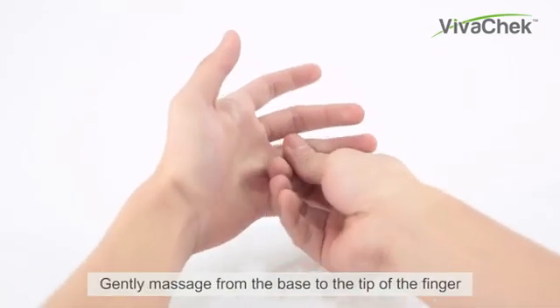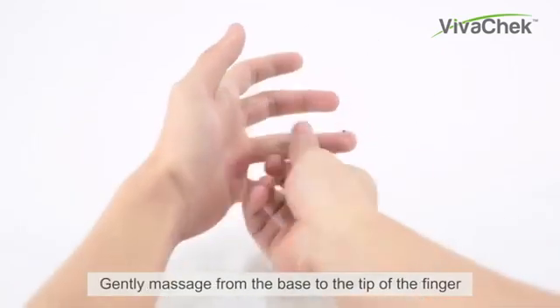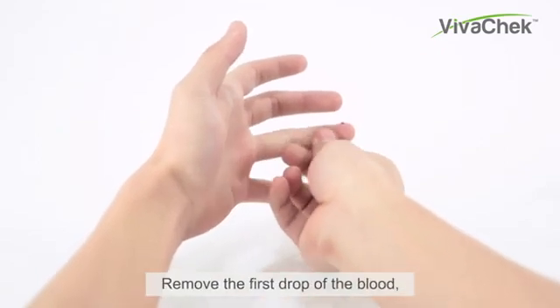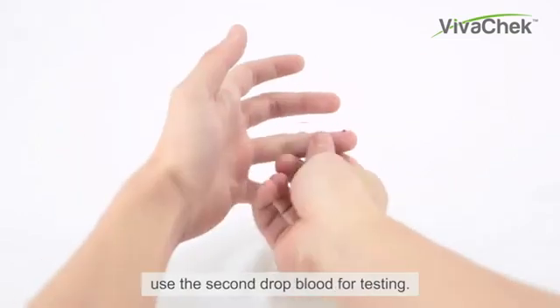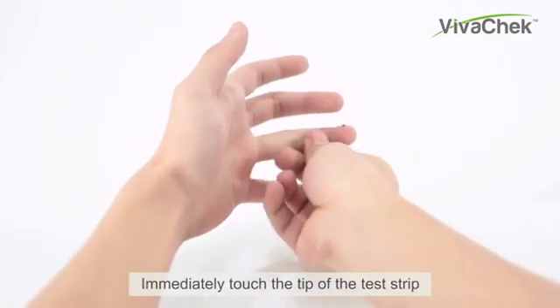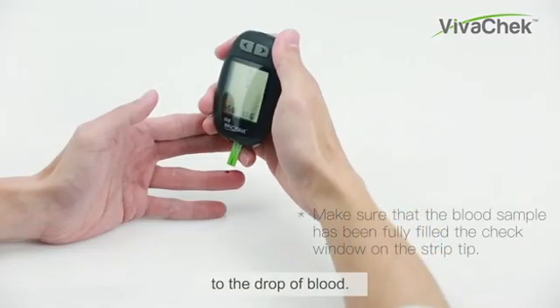Gently massage from the base to the tip of the finger to obtain the required blood volume. Remove the first drop of blood and use the second drop of blood for the test.